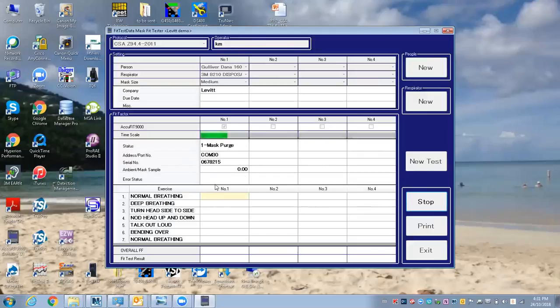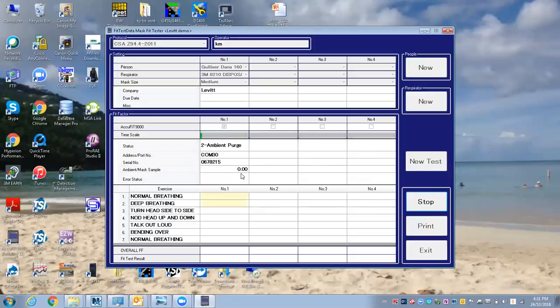Usually with this, I can tell in the first exercise, if this is very close to zero, very low, then you know you have a good fit. If it's bouncing around and fairly high, you know there's some leaks, so it's not even worth continuing.